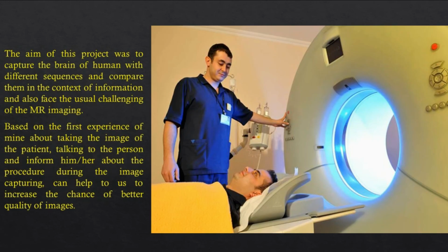The aim of this project was to capture the brain of a human with different sequences and compare them in the context of information and also face the usual challenges of MR imaging. As can be seen in different slices, some rings have appeared which are because of volunteer motions. Although a special box protects the head of the volunteer to decrease unnecessary movements, these motions and related artifacts cannot be avoided. Based on my first experience of taking the image of a patient, talking to the person and informing him or her about the procedure during image capturing can help us to increase the chance of better quality of images. Thank you very much.